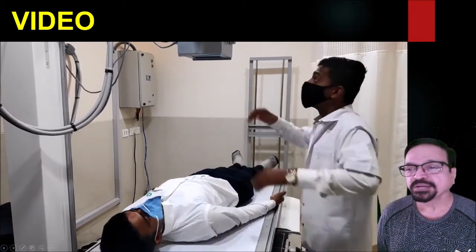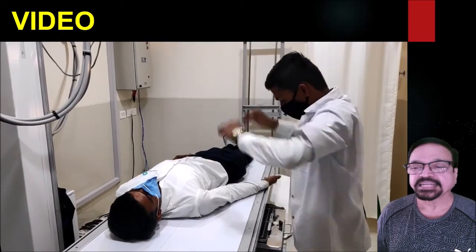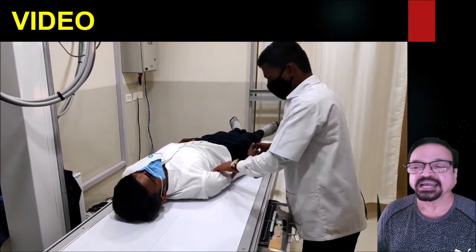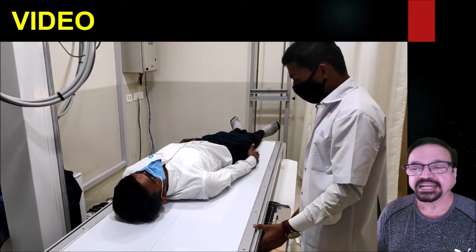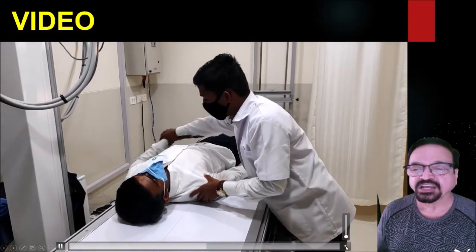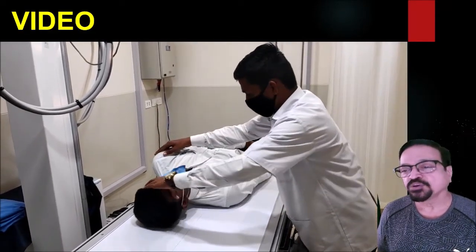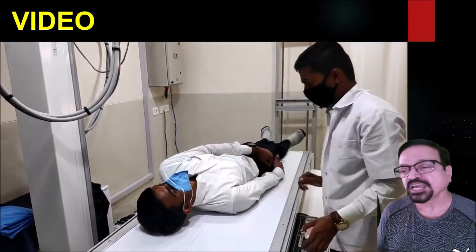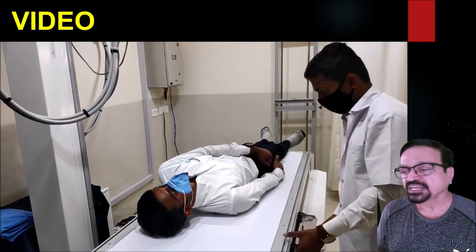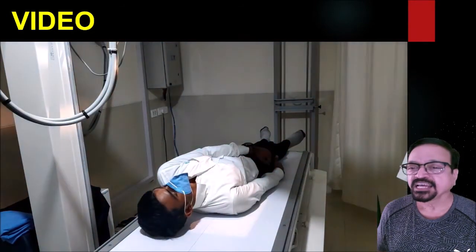Now here you have to get the patient below the central ray. Centering, as I told you, is very easy — feel the acromion process. Now see the hand position and the neck position. The thumb has to be up — that is a neutral position. You can give proper instructions to the patient. Whether the patient is experiencing any pain needs to be noted by the technician while taking the radiograph. Now see he is elevating the opposite side shoulder. This can either be done by holding the edge of the table. Otherwise a sandbag might have to be used. Now this is the cassette — a DR cassette — which is placed and everything is set for the exposure.